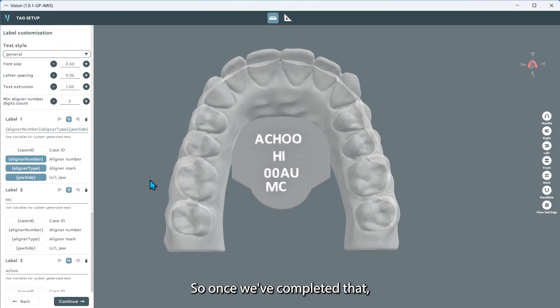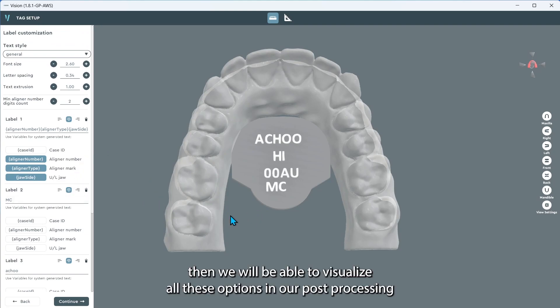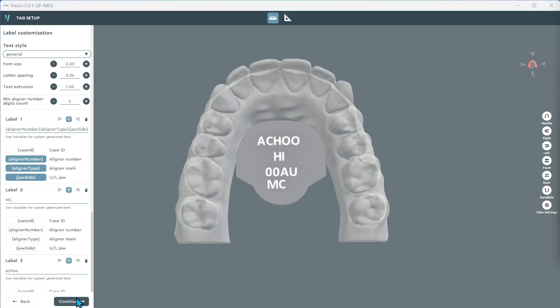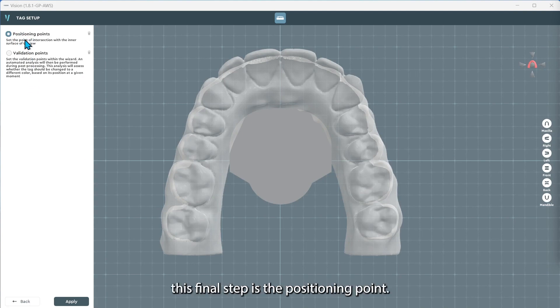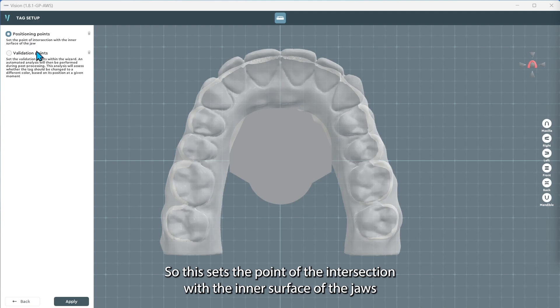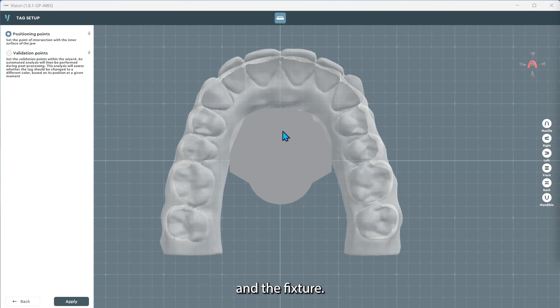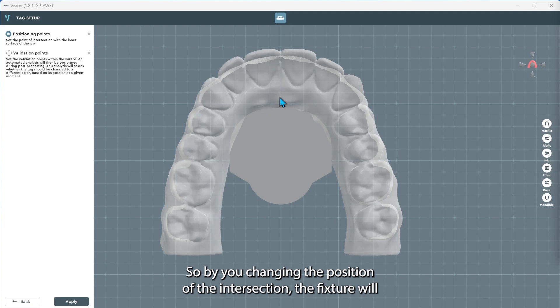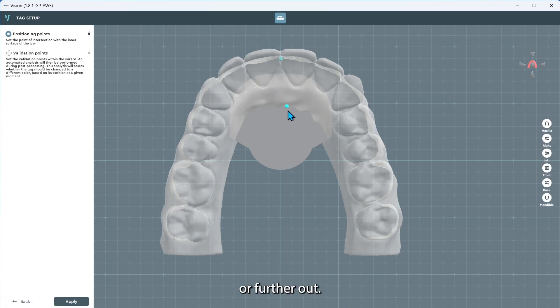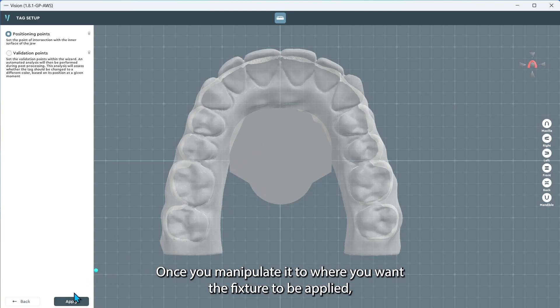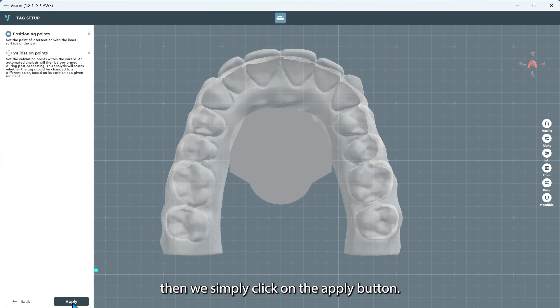Once we've completed that, we will be able to visualize all these options in our post-processing. In this final step is the positioning point. This sets the point of intersection with the inner surface of the jaws and the fixture. By changing the position of the intersection, the fixture will be placed further into the structure of the model or further out. Once you've manipulated it to where you want the fixture applied, we simply click on the apply button.